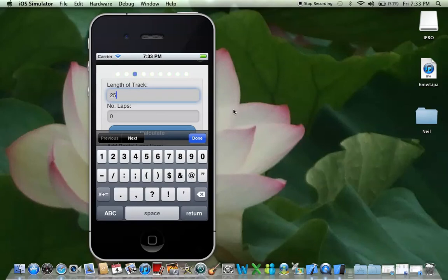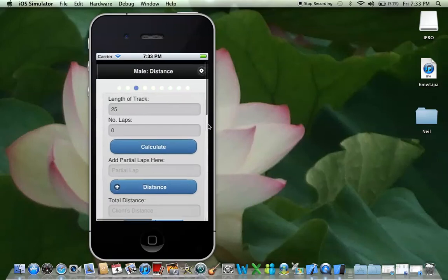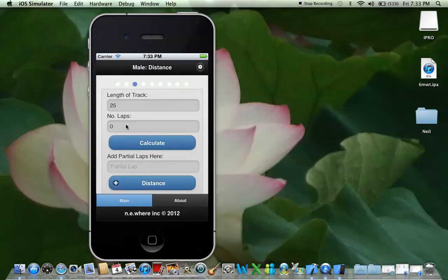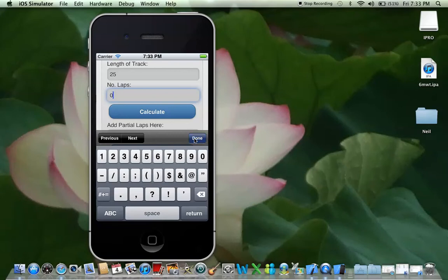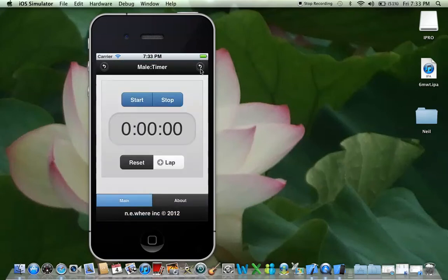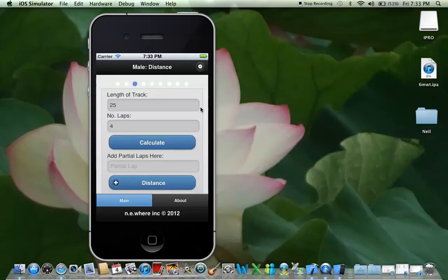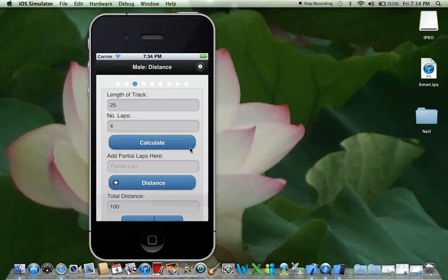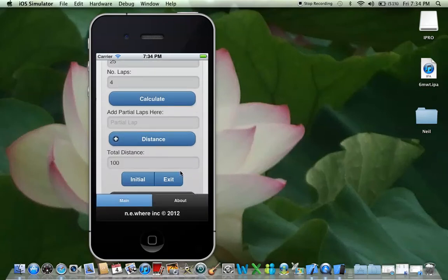You can pre-enter your length of track. You can put in the number of laps they do, but I find that if you bring up the stopwatch and add the laps as you go, when you press the add lap button, the device should vibrate to notify you that you're adding laps. Press it four times and it's up to number four — you'd then calculate that. That's a really poor walk test, by the way.